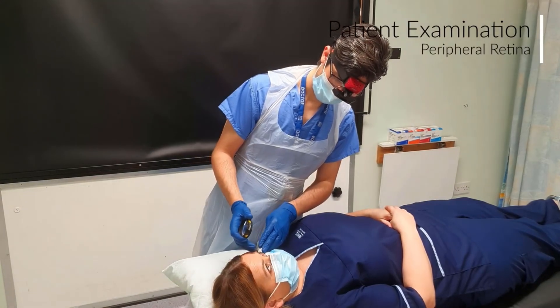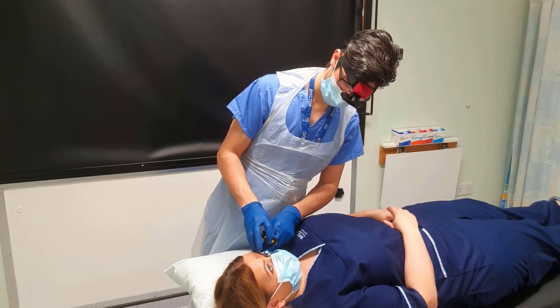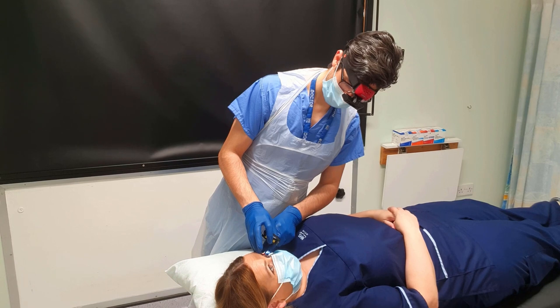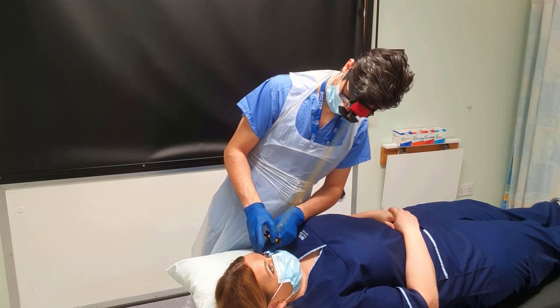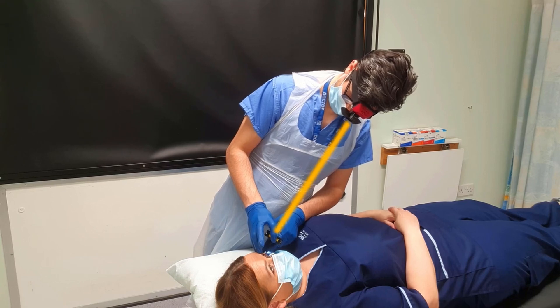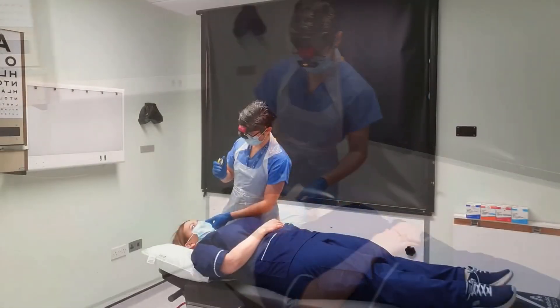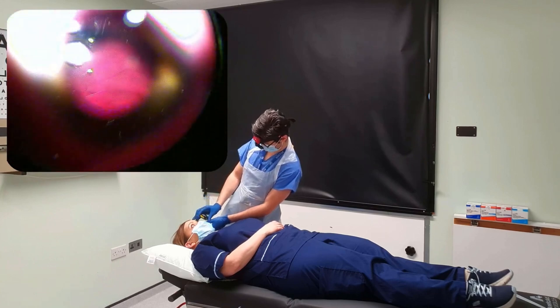To view the peripheral retina, change the angulation by asking the patient to look in the direction of the area to be examined. You can move around the bed and tilt your body to view the peripheral fundus. To see the superior and inferior fundus, you may find it easier to stand at the temporal side of the patient as shown here. This skill takes practice as you may find you keep losing your view. This is likely due to incorrect alignment of the BIO, condensing lens, and the peripheral fundus. If this happens, try to adjust the angle of examination and ensure that you are in line correctly.